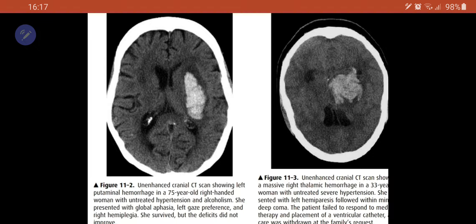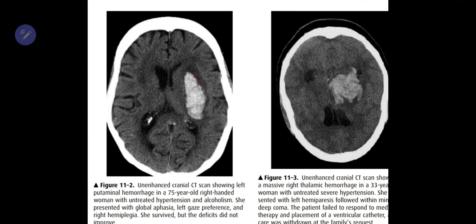15% of all strokes are caused by hemorrhagic strokes and the majority of them are intra-parenchymal bleeds. CT is the best investigation of choice to look for bleeds in the brain. Let us review some of the CT findings that we might find in intra-parenchymal bleeds.